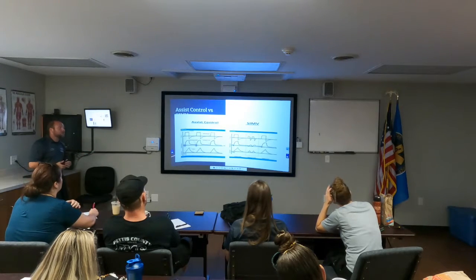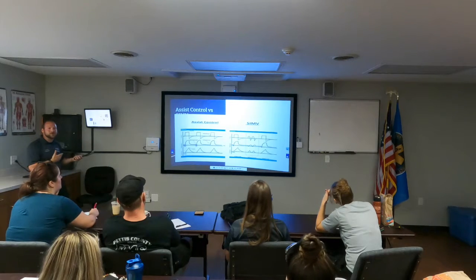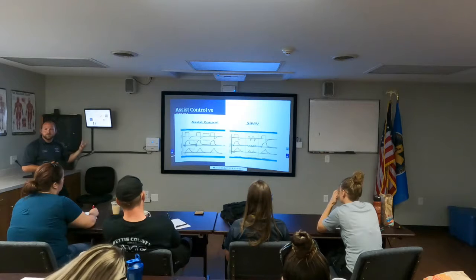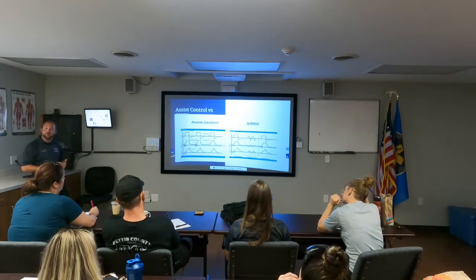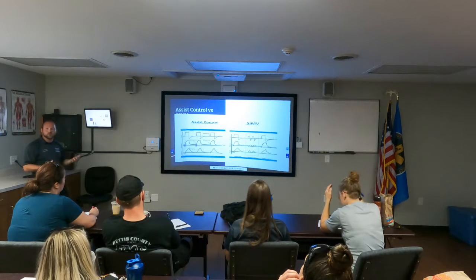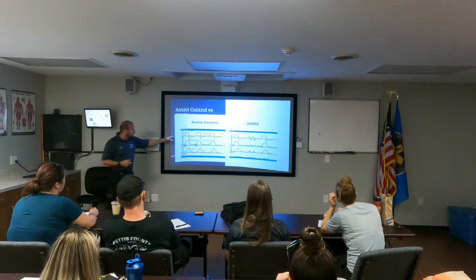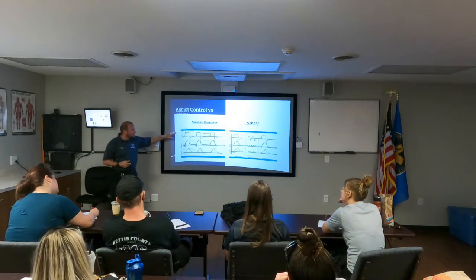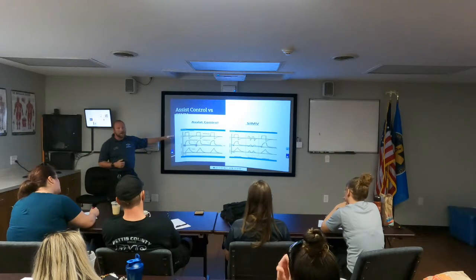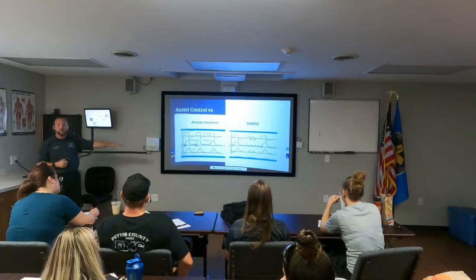So what we're going to see on our ventilator is the different waveforms between AC and SIMV. We're not going to see too much of a difference with our CPAP and BiPAP because that's all patient dependent. We don't have a set on what that's going to be. There's no constant with that, so it's always going to be changing. But with assist control, as we look here, we have flow, pressure, and volume, both sides. As we see with our flow rate or our rise time with assist control, it's pretty squared off, always consistently going to be the same.